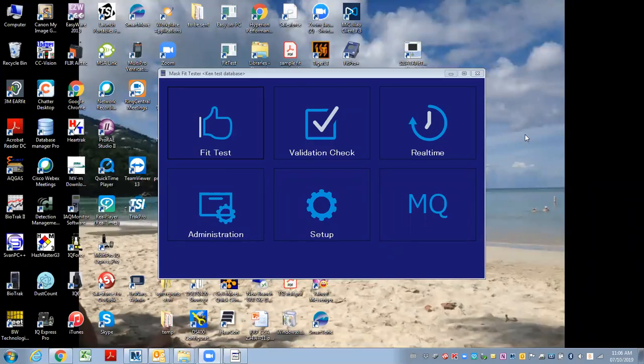The AccuFit 9000 can be used directly connected to a computer with this software, or you can use it standalone with a separate USB flash drive. If you're using it standalone with the flash drive, you have to create a database on the flash drive.